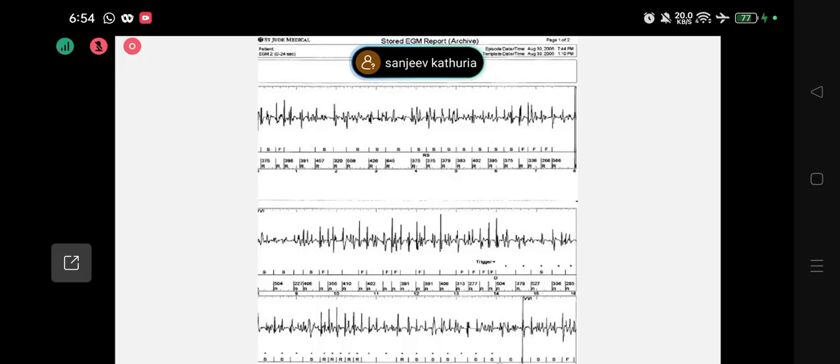So capacitor means there is a charge. How is the energy delivered? This biophysics, the shock, is what? Energy, joules. It has to be created in the device. So the device has a battery and a capacitor. As soon as all these things are detected by electrical activity, the capacitor starts charging. The capacitor is the one which has the capacity to deliver energy.